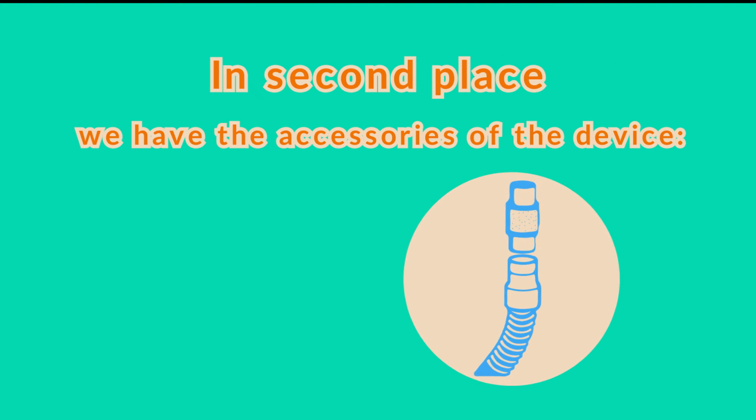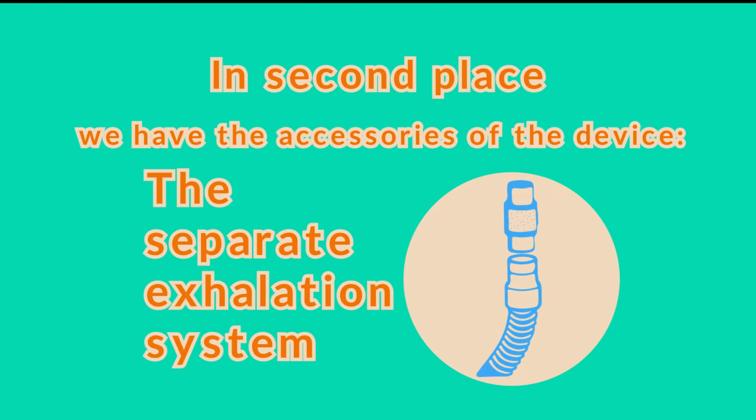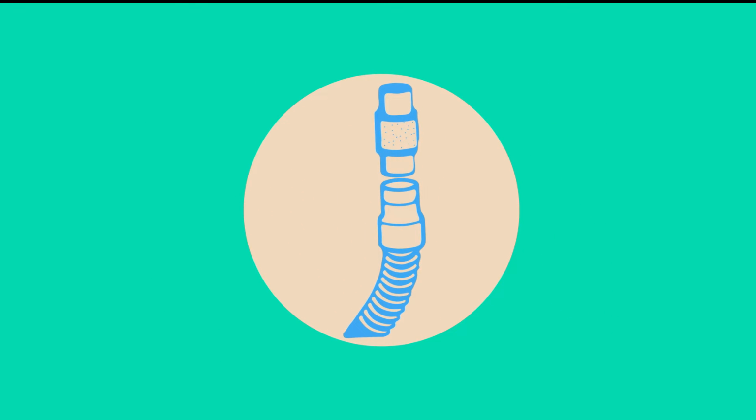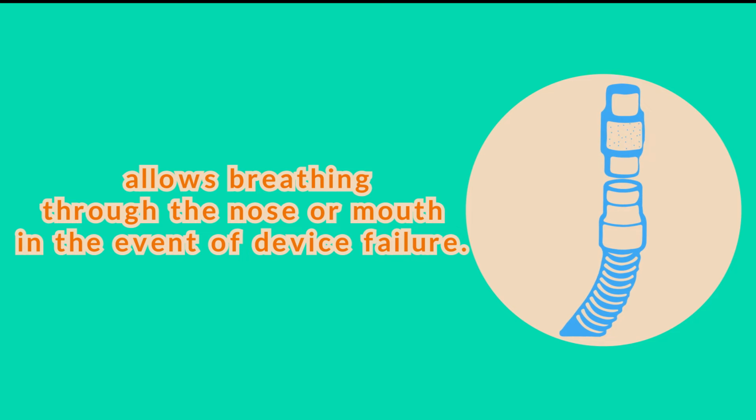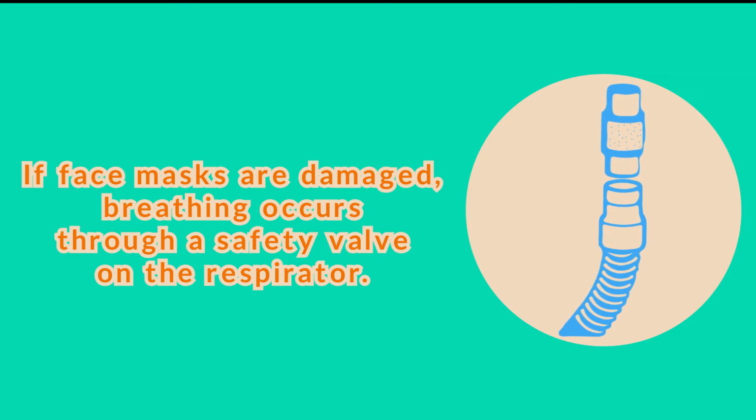In second place, we have the accessories of the device. The separate exhalation system. It should be noted that exhalation systems allow air rich in carbon dioxide to be expelled from the mask and flexible tubes of the device, avoiding a critical increase in the values that make it difficult for the patient to breathe. In the case of separate exhalation systems, it allows breathing through the nose or mouth in the event of device failure. If face masks are damaged, breathing occurs through a safety valve on the respirator.